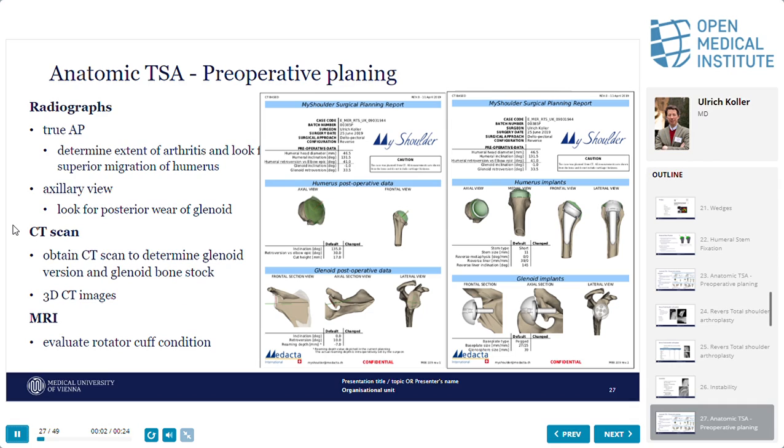When you get this protocol, you also know the inclination, here 0 degrees of inclination, but in most cases we see 6 degrees of superior inclination, and so on. So this gives me good and precise information on how the glenoid is fixed.